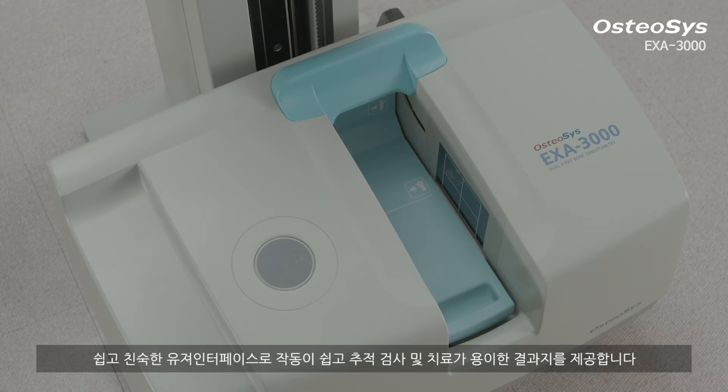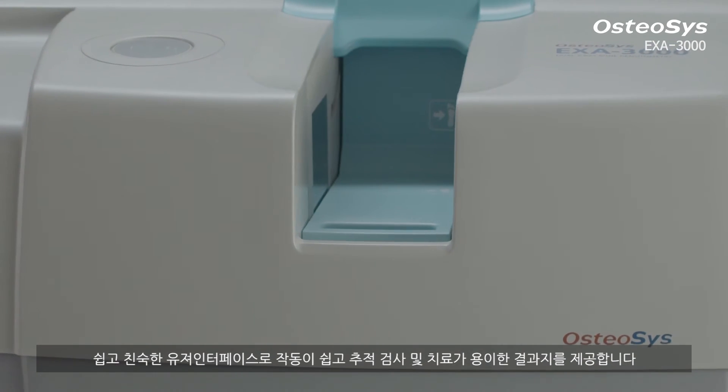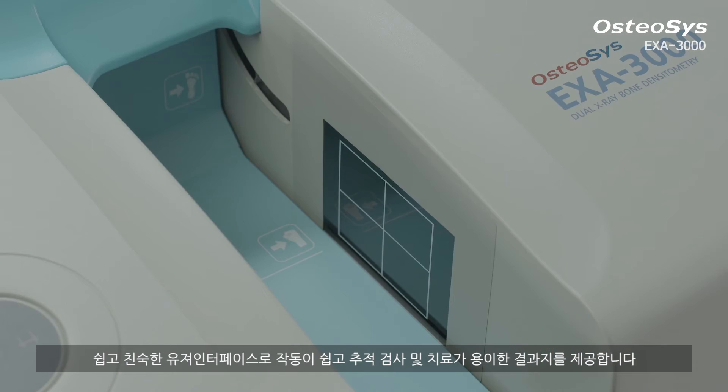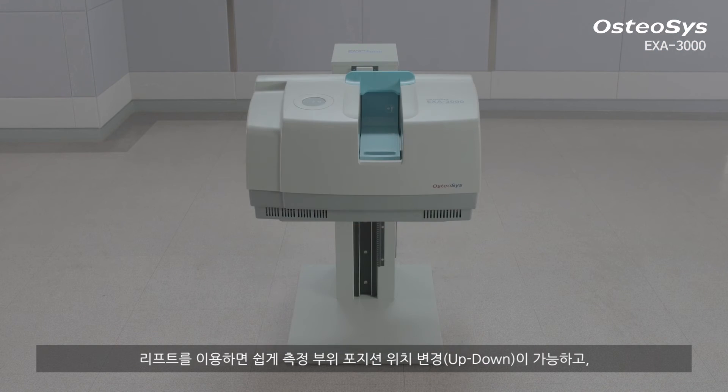The easy operation and user-friendly interface of Exa3000 offers a special result report suggesting a follow-up test and relevant treatment. If you use the lifter, you can easily change the position of the measuring area.